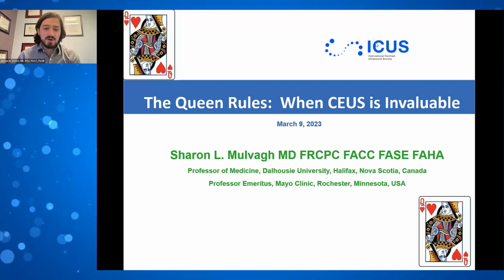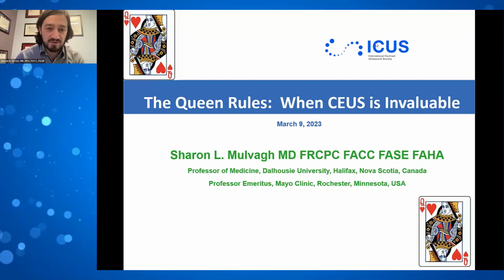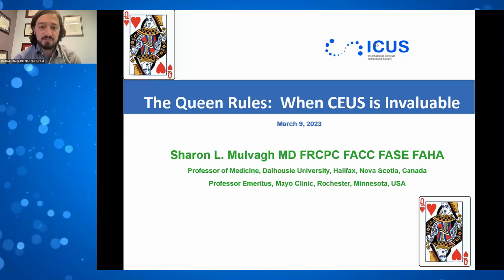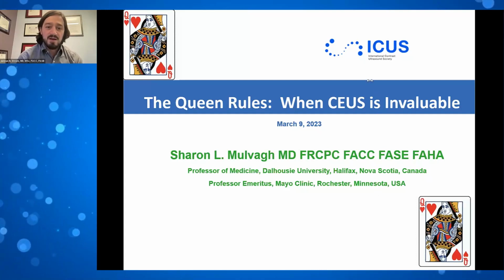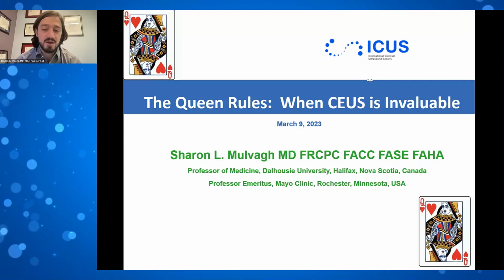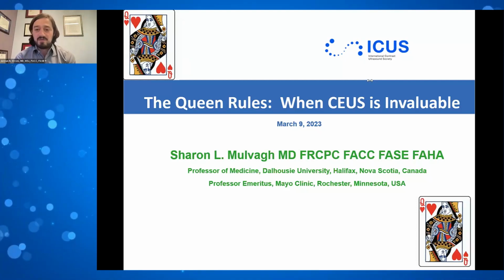And Sharon, I don't want to cut too much into your timing here, but I just want to address the question that was asked in the Q&A very quickly. The question, to repeat, is: do you have a specific explanation that your texts give to patients so that they inform patients properly? Also, do you know if this is something that needs to receive a prior authorization by insurance companies, or is this a generally covered procedure? So I'll answer the second question first, which is it is very much a covered procedure.